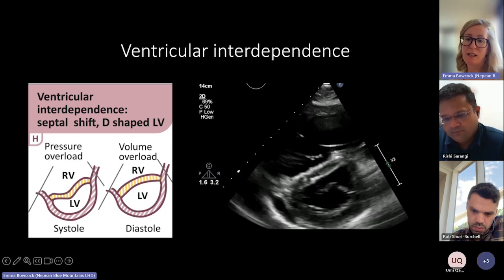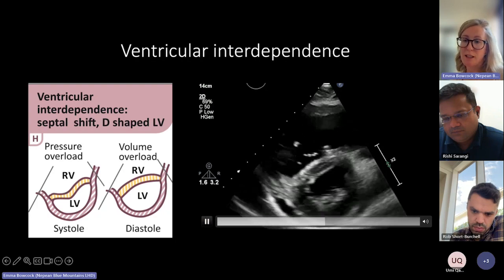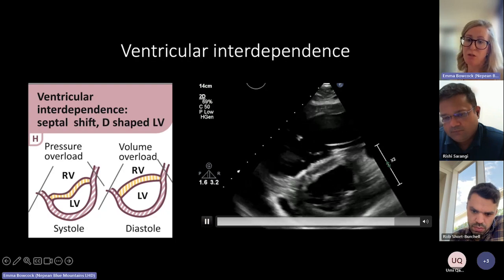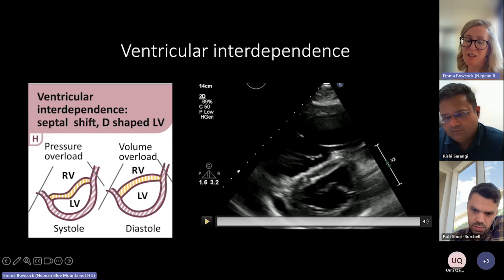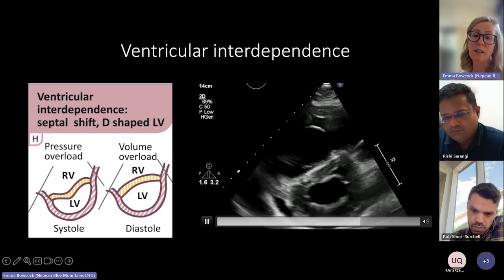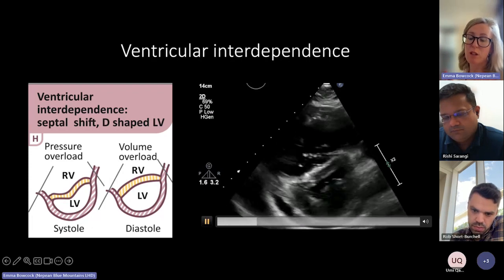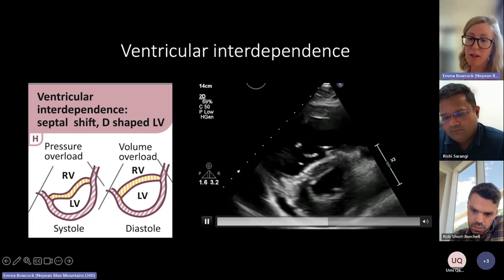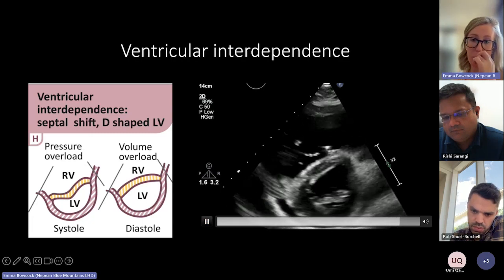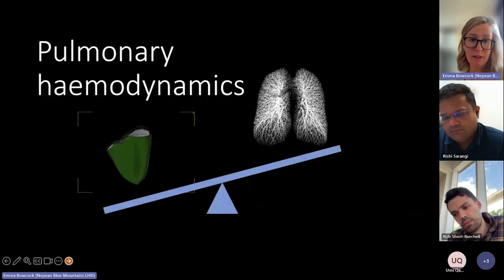This is, again, as you can see, a patient with chronic pulmonary hypertension. Why do I say that? He's got a thickened RV free wall. You can almost see the tricuspid valve on fast. There's a pacing wire in there as well. You just get the feel that this is a ventricle that's remodeled and become that rectangular sort of shape. You can see a pericardial effusion and complete ventricular interdependence throughout the whole cardiac cycle.